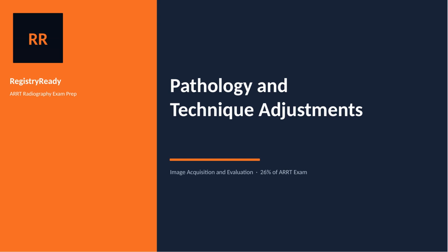Equipment Lesson 20 covers pathology and technique adjustments, an advanced lesson and one of the most clinically applicable topics on the ARRT. Pathology changes tissue density. Technique must compensate. Every patient you image may have a condition that requires you to deviate from the standard technique chart. This lesson covers additive versus destructive pathology, cast and foreign material adjustments, body habitus, special populations, and contrast media considerations.